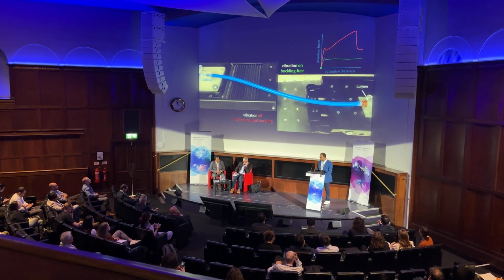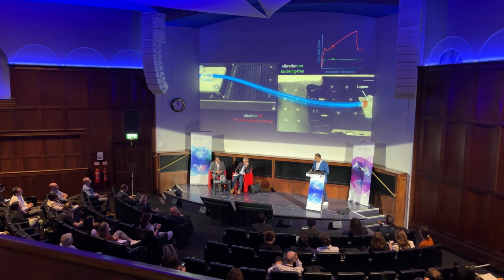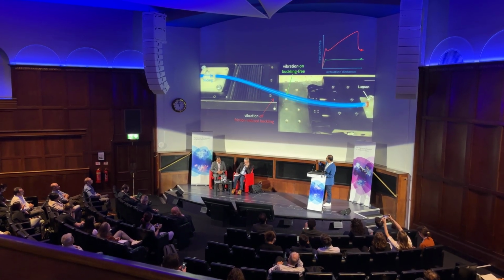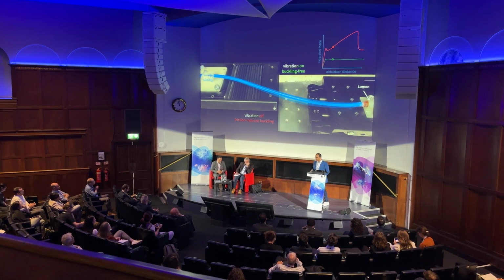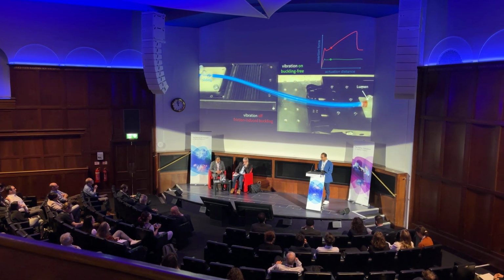So we integrated one friction control module at the tip and started inserting this catheter into a lumen. You can see that in the off case, without any vibrations, the catheter buckles as we expected. However, when we activate vibrations, it maintains its configuration, confirming that we can eliminate buckling and have a buckling-free insertion process.